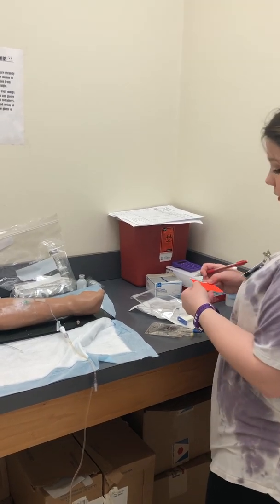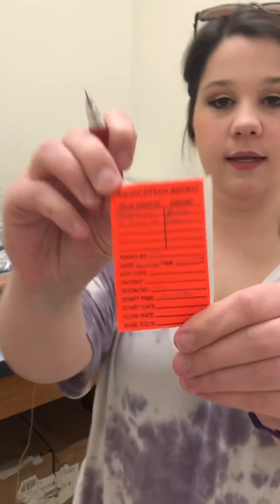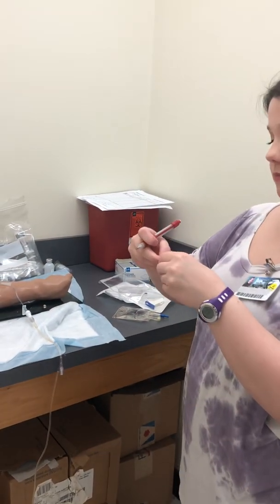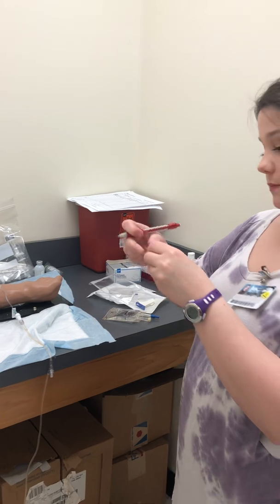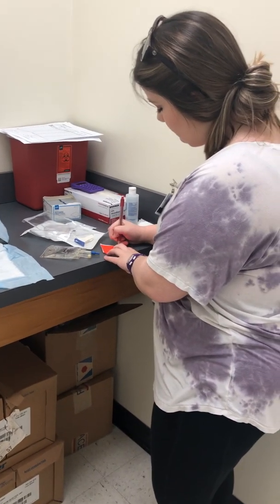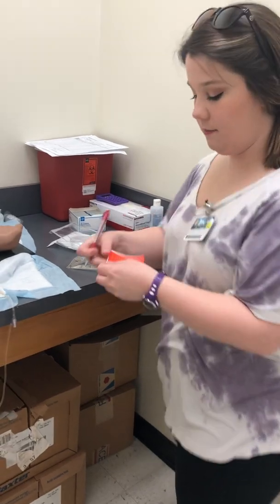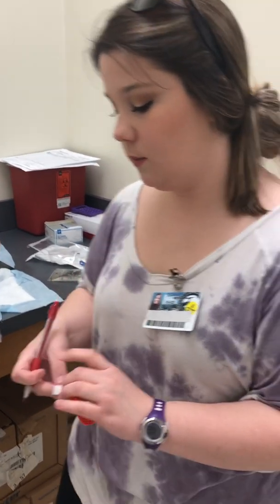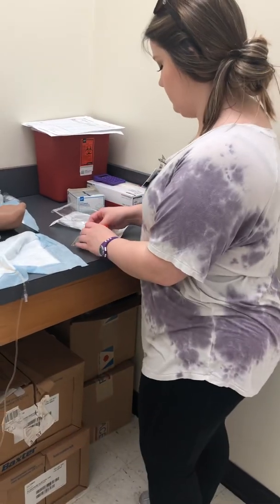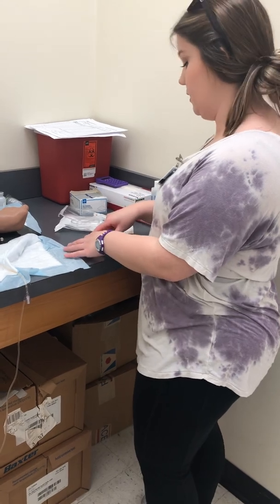And there was 80 milligrams added. And there's my label. I've got the patient's name, my initials, what I'm giving, how much it is, and the time, and what it's mixed in. Okay.